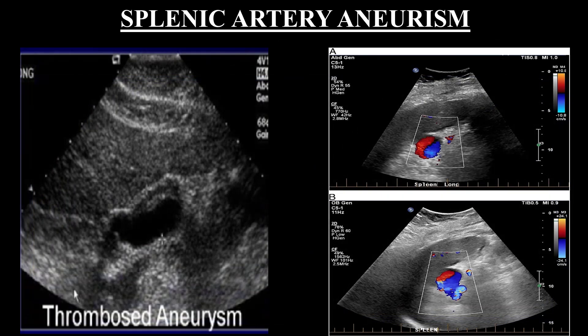These images show different cases of splenic artery aneurysms. In this color Doppler, we show the yin-yang sign of aneurysmal dilatation of the splenic artery, and in the 2D image we have a thrombosed aneurysm of the splenic artery.